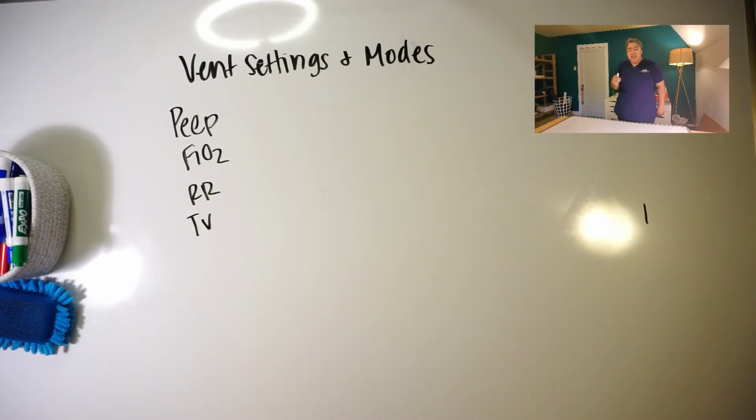So you get an ABG, and you have some numbers that you don't really like. Say you're not maxed out on your vent settings yet. Well, we can probably adjust that ABG. Now what you have to remember is that when you're looking at an ABG, it's either respiratory or metabolically driven.